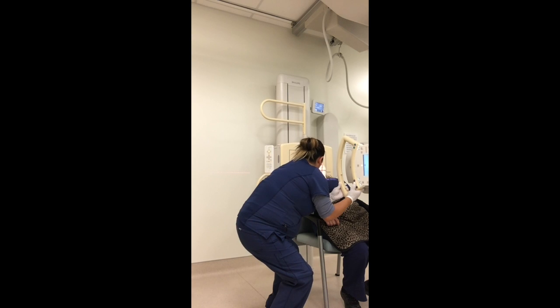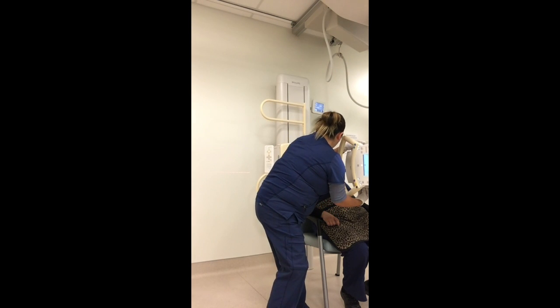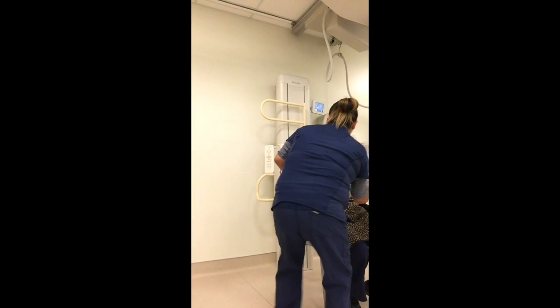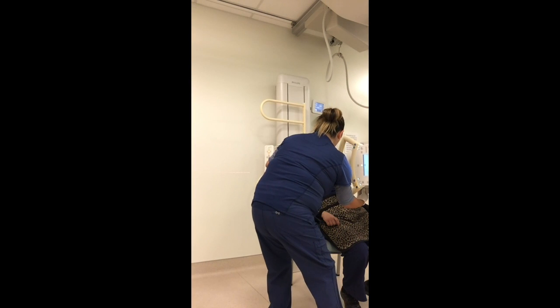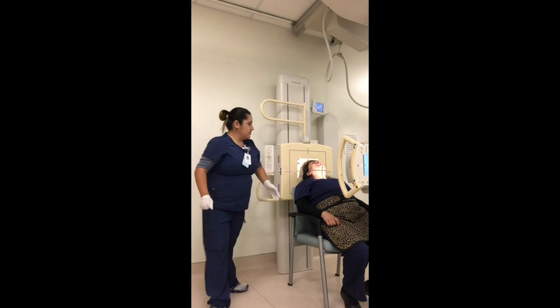Little bit. Bring it down. Collimation. Put my marker on her right side.